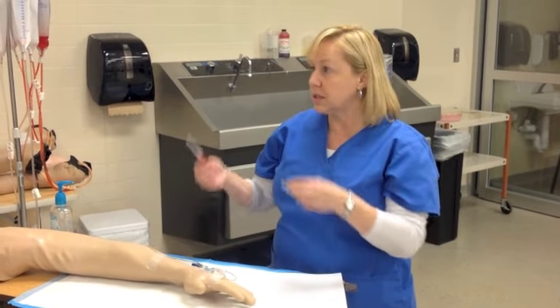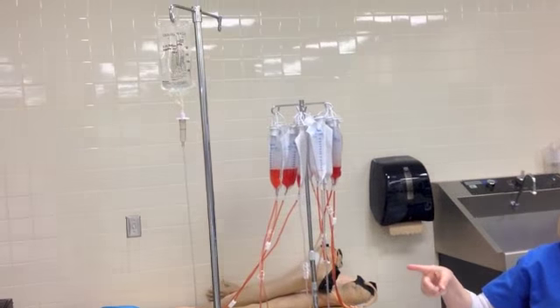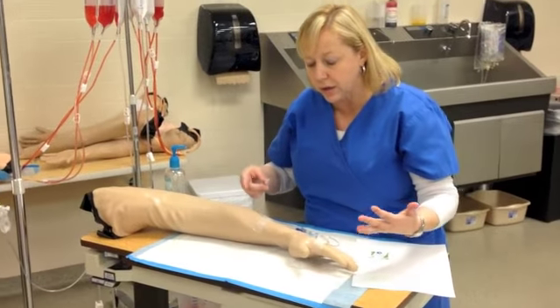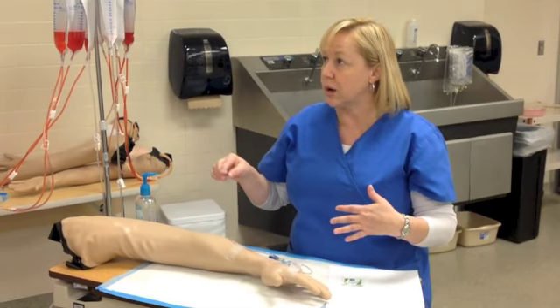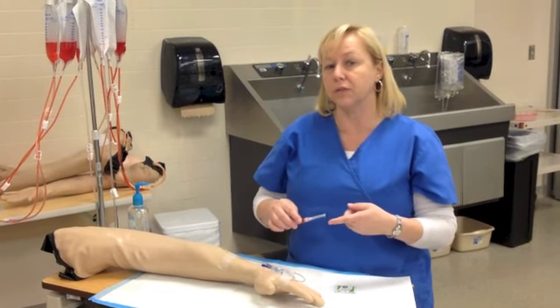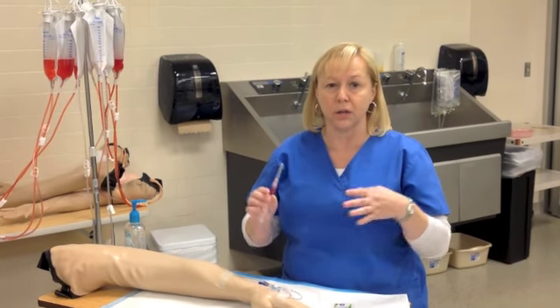Now, when I walk into this particular patient's room, I notice that the IV is running. If the IV is running when I go in, I simply check my site to be sure there's no swelling, there's no redness. I'm looking for infiltration or phlebitis. If there's none of that present and the IV's running okay, then I can simply push this medication. That means I don't have to flush it before, and if it's running, I don't have to push after. And I'm going to demonstrate that.